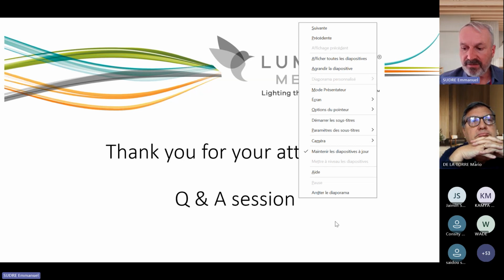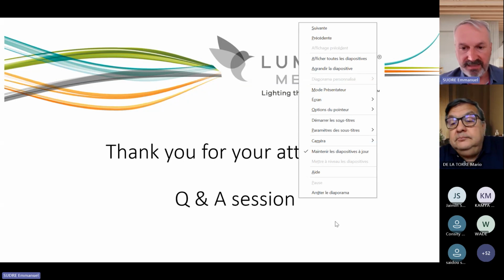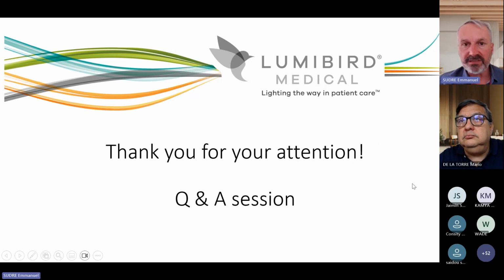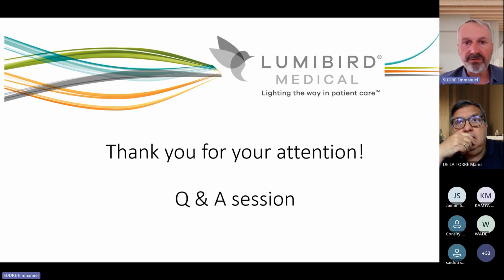In comparison, we don't have many data about MLT technology, not enough proof about the efficacy, and also about the possible repetition of the treatment. With SLT, with more than 25 years of experience, now we are sure that it is a repeatable procedure. With MLT, we don't know yet.